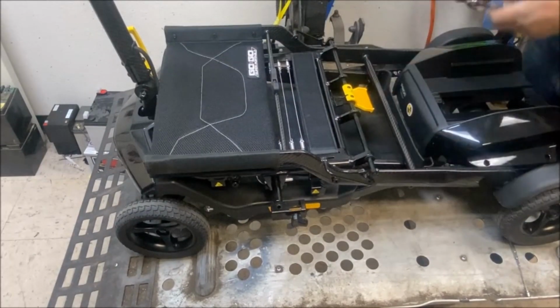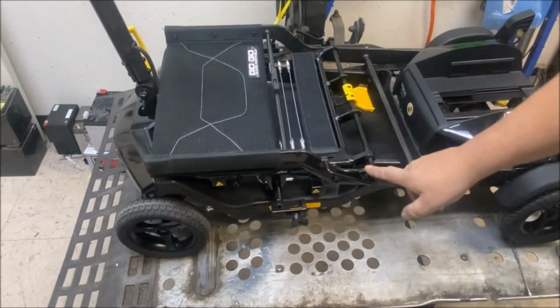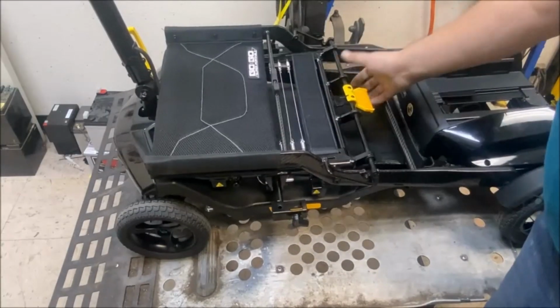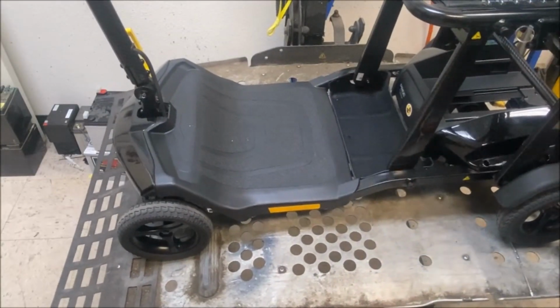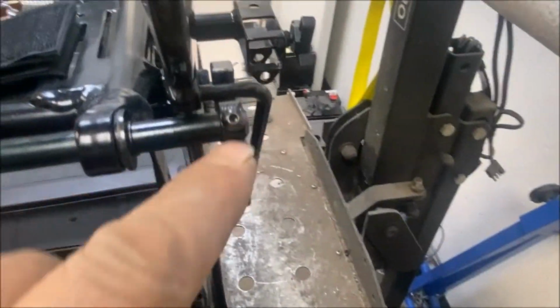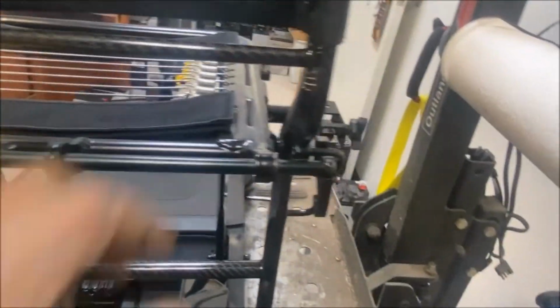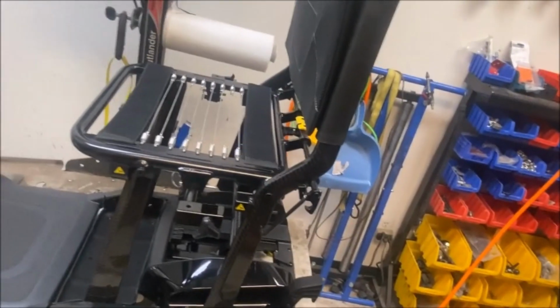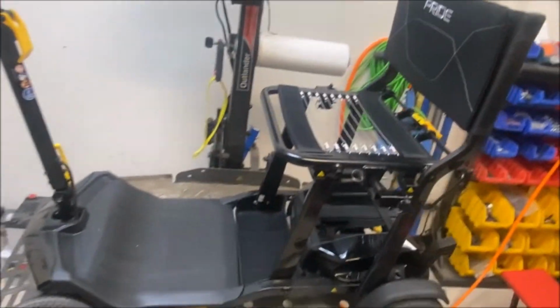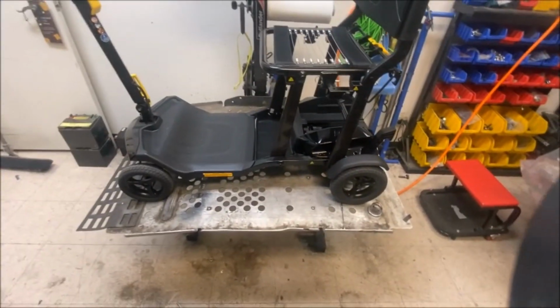May have to adjust the closure mechanism. As long as it clips in when you fold like that, and clips in when it's upright, which it does, I don't need to adjust it, but you can adjust it if you need to with these Allen screws, to close correctly. Yeah, that's that done. I've just got a seat cover in the bag to put back on, and the armrests. I'll give it a quick wipe over. But, yeah, it's done.